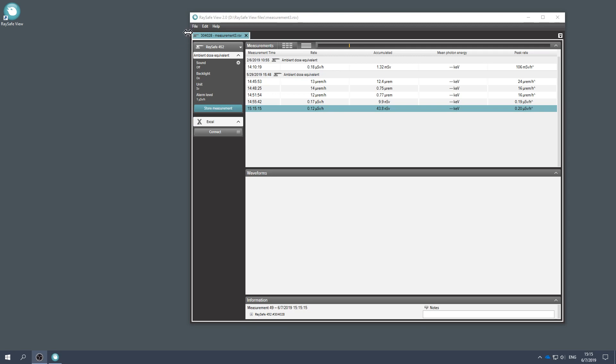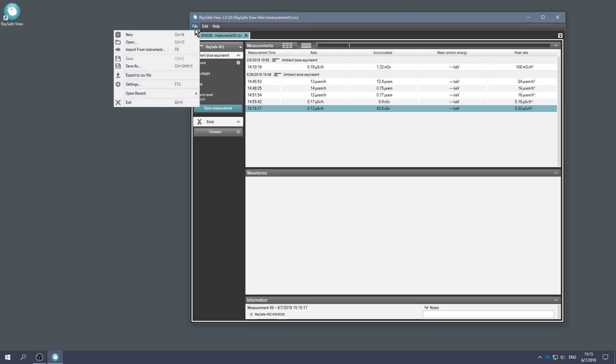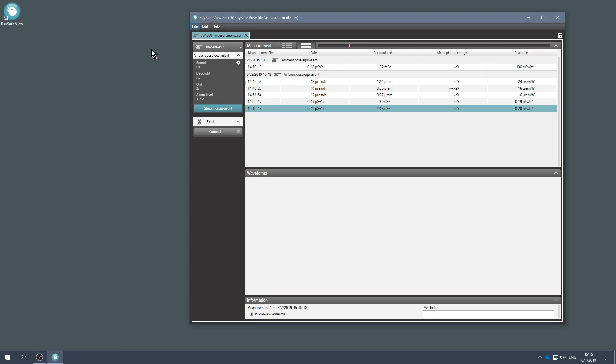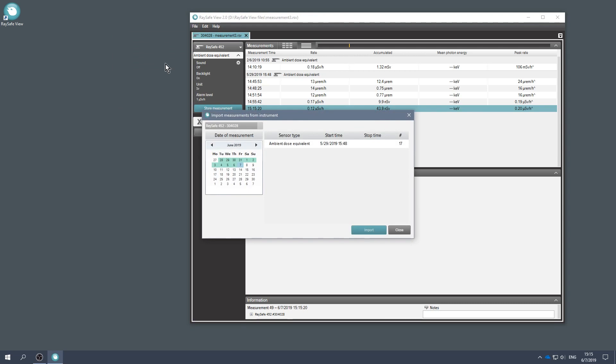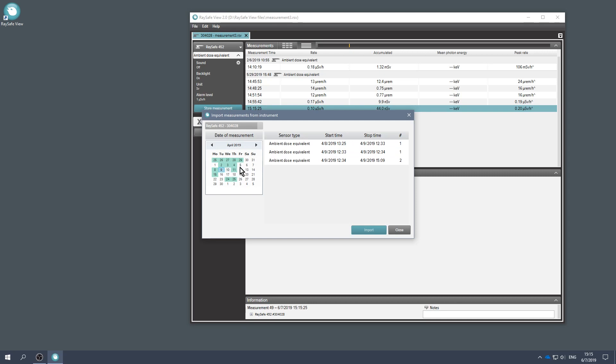To import stored measurements, go to the File menu and click Import from Instrument. Select the sessions you want and click Import.